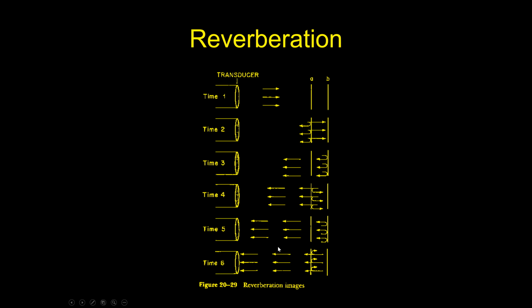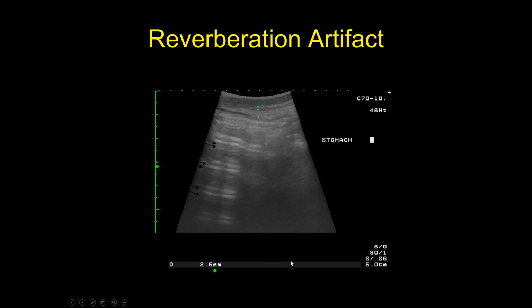So we get a second volley of sound that comes back towards the probe that over time will hit the probe surface and will create a second white line. So we get two individual, that's again, we're back into that resolution thing. We get two surfaces that have enough distance between them where we will get two separate white lines on our ultrasound machine picture.